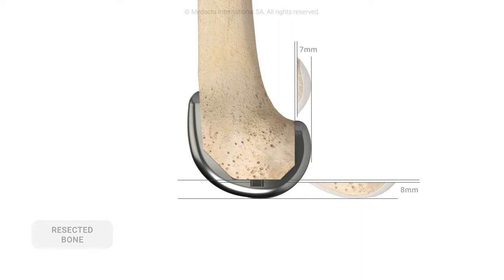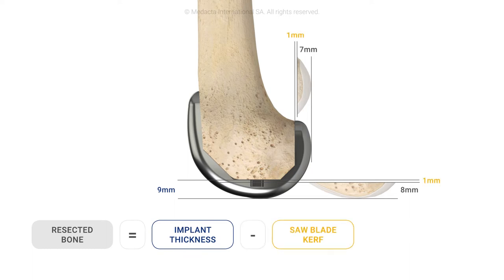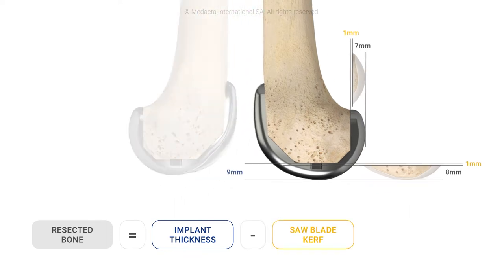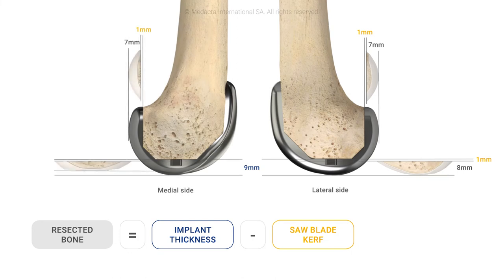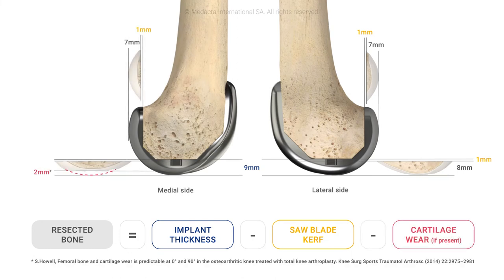Every step can be verified by measuring the resected bone. On the unworn side this equals the implant thickness minus one millimeter of saw blade kerf. On the worn side, another two millimeters of missing cartilage should be considered and subtracted.